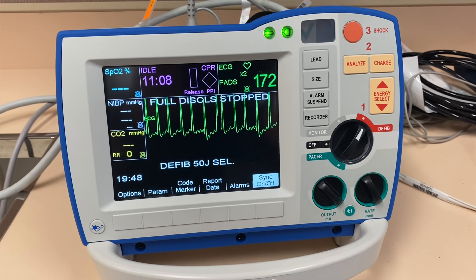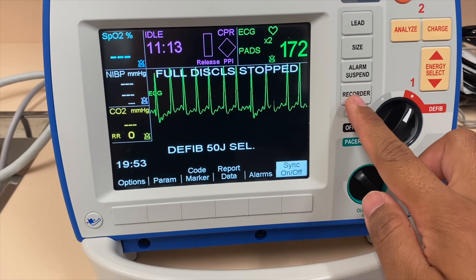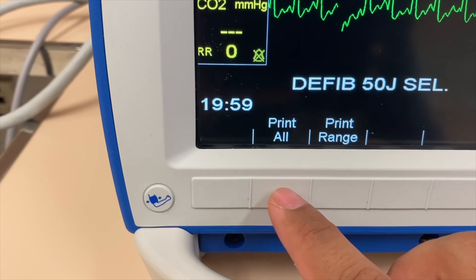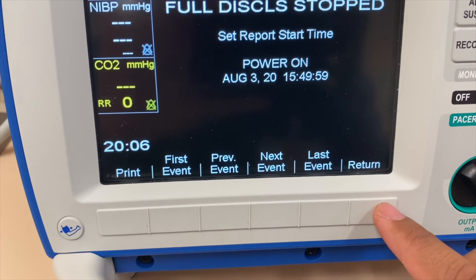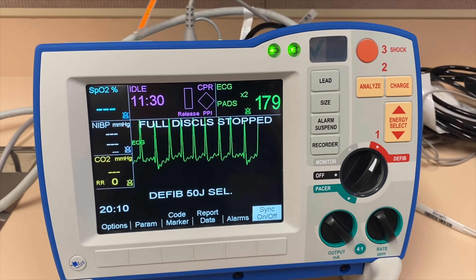If you want to print any strip, you can always click Recorder or go to Report Data here. Once you click it, you can either print chart, print all, or print range. It will give you an option for which event. That's how you print your data.